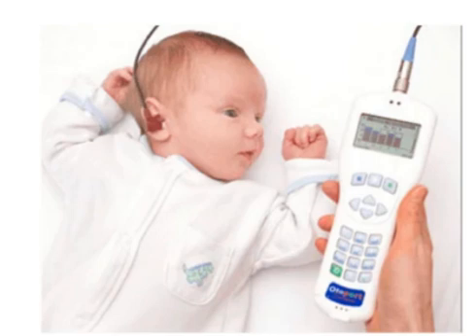This is in contrast to tone burst stimuli delivered at a narrower frequency range, especially at lower frequencies, to obtain more frequency-specific responses. Since the response emission contains the same frequencies as the stimuli, distinguishing the response emission can be challenging. Multiple repeated stimuli are required to average and distinguish the response emission from the initial stimulus. Response emissions are recorded at 2 to 23 millisecond latencies corresponding to the frequency of the stimulus.